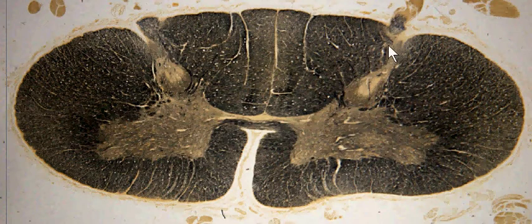The posterior columns with fasciculus gracilis and the fasciculus cuneatus. The dorsal horn, the ventral horn. We have to use our imagination here to see the lateral corticospinal tract on each side and the lateral spinothalamic tract on each side.